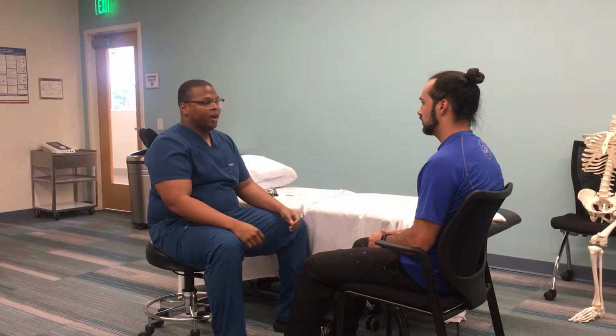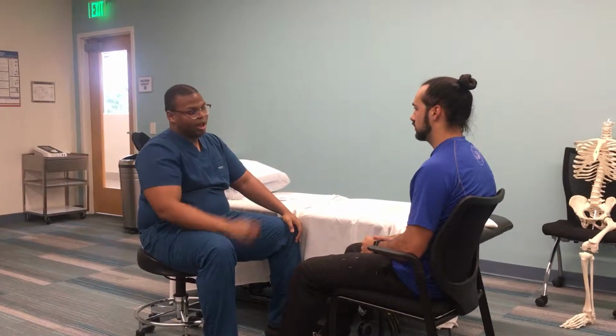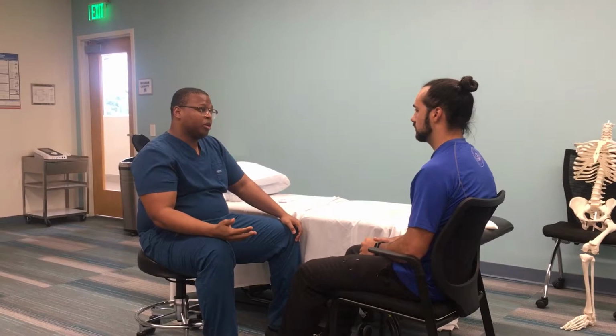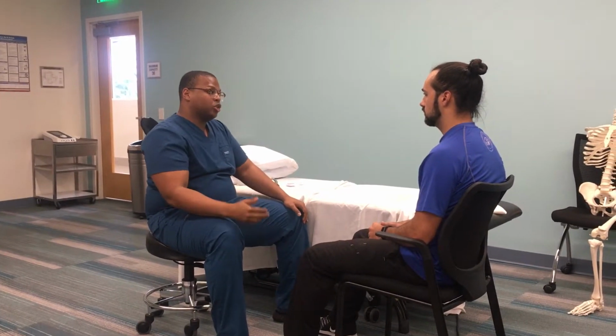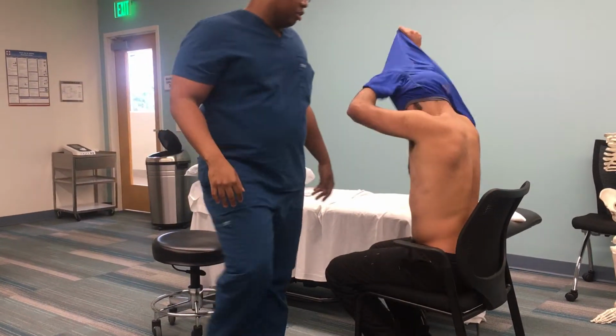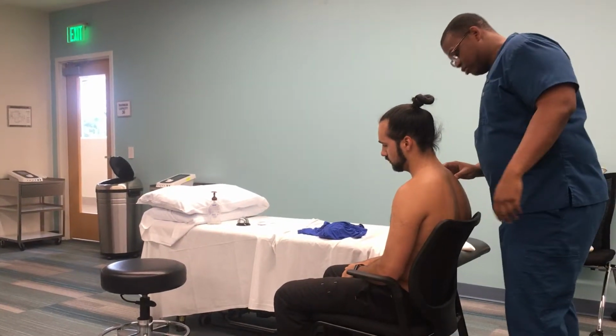Well, I've done your ortho eval already. I've reviewed your chart. I've decided that the best course of action for your upper trap tightness and pain is to do some heat therapy. This is before we start doing our interventions. So that's going to require you to take off your shirt and lay down on the table on your stomach. Is that something you're comfortable with? Yes. Can you remove your shirt for me? I just want to inspect the area before we start. No rashes, no wounds. Okay.